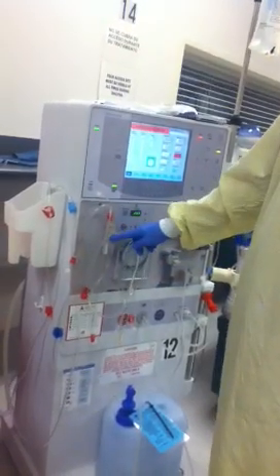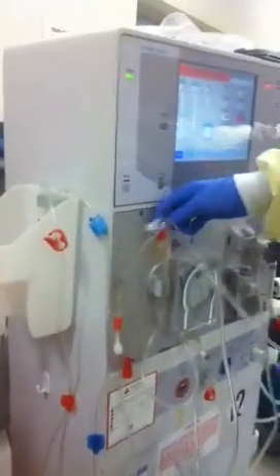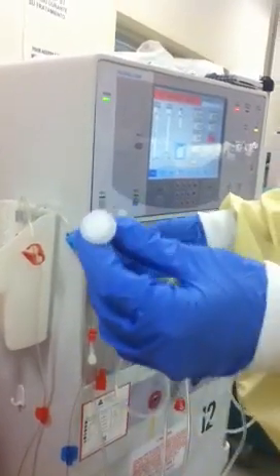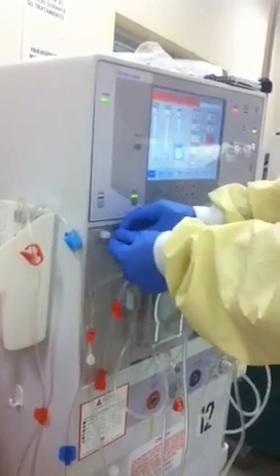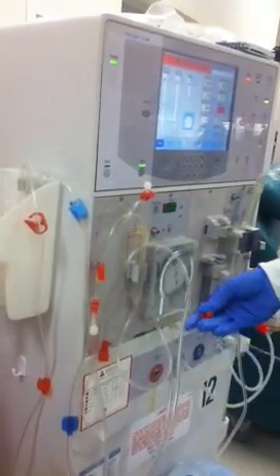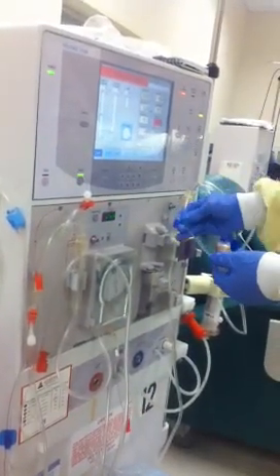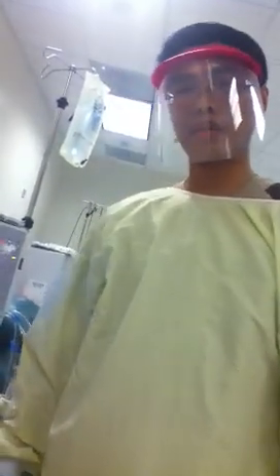Then after putting the arterial line, we need to clamp five clamps. This one, the transducer, the arterial line. This one. The line of heparin, and clamp this one here, and the big one is this one. So that ends the first part of priming the dialyzer.